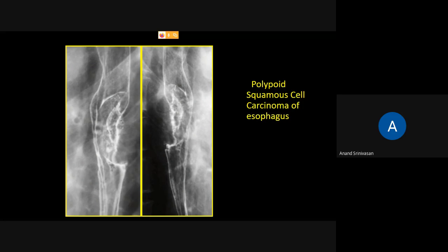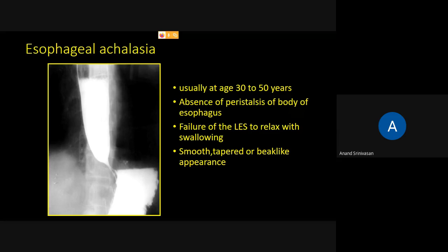All right, here is another barium swallow, but here you can see a very large irregular space-filling defect, indicating that there is a growth in the esophagus in this region. That could be because of the most common carcinoma present in the esophagus, the squamous cell carcinoma.